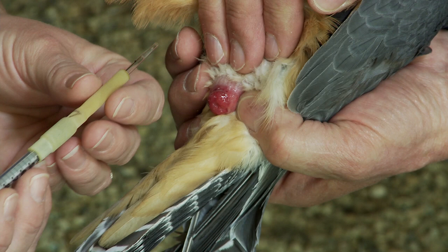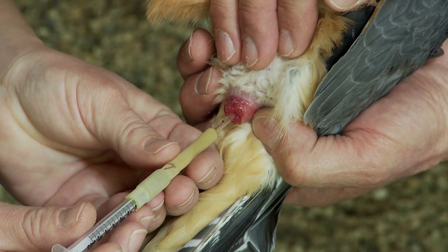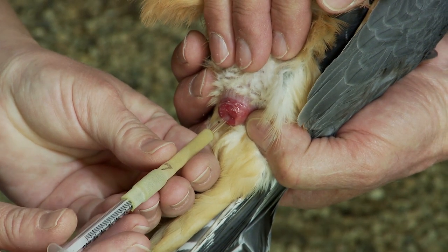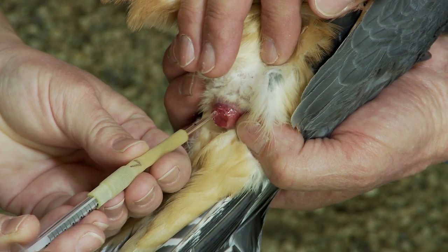The opening is a depression in the center of the mass of tissue. The artificial insemination tube is inserted no more than 2 to 3 centimeters. In a coordinated effort, the artificial insemination plunger is pushed at the same time the pressure is removed from the abdomen. This allows the oviduct to draw off the artificial insemination tube, providing space for the semen in the oviduct, and usually little to no semen is expelled around the artificial insemination tube.